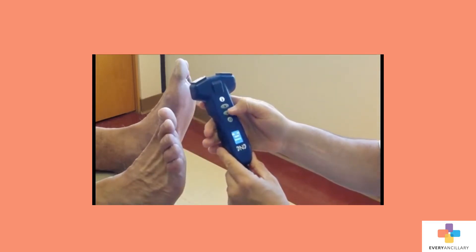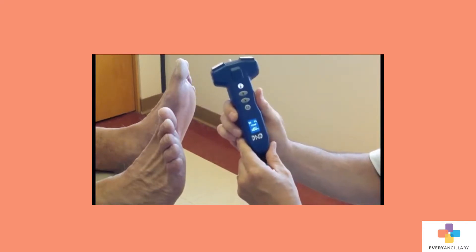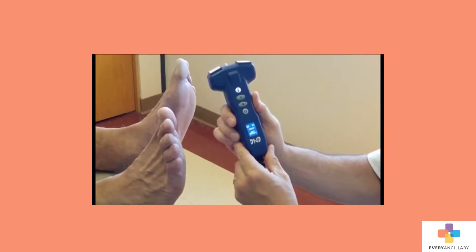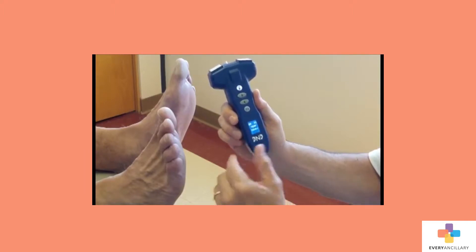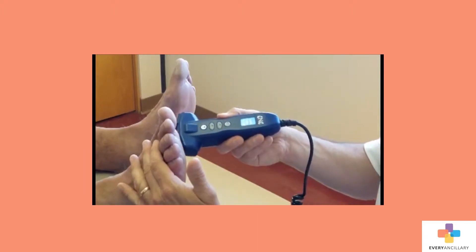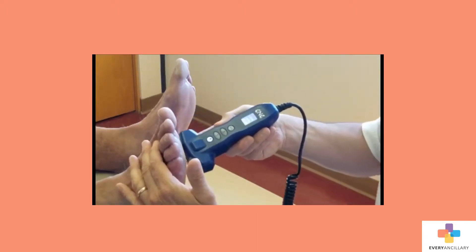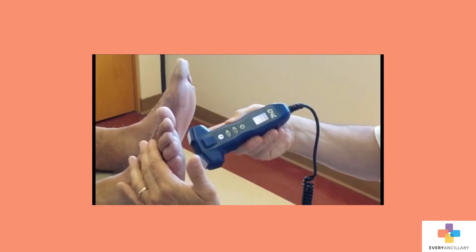Okay, we're going to increase the difference to 4 degrees. Once the unit is ready, can you feel the difference between these two? No, I can't.